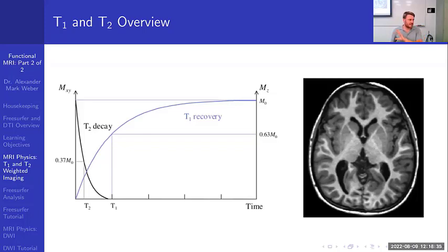That is, let's go back to that precessional frequency that hydrogens are spinning at inside the magnet. Protons with intermediate binding tumble at a Larmor frequency, and by intermediate, we're talking about being bound to something like fatty tissue. So protons or water in the fatty tissue will be closer to the Larmor frequency.